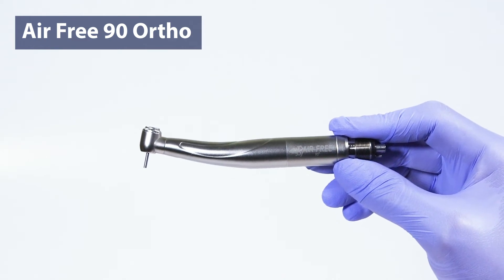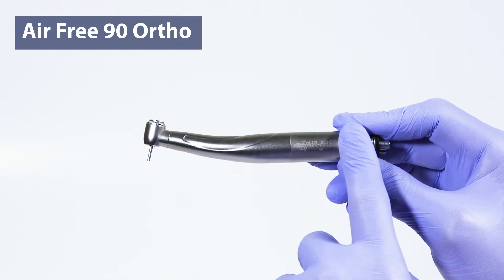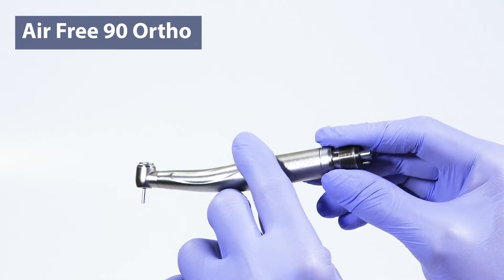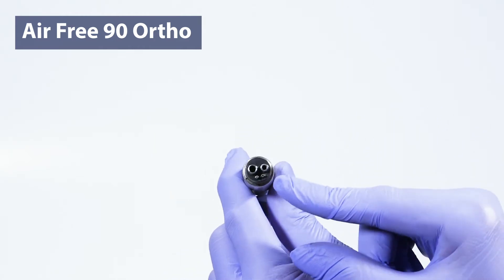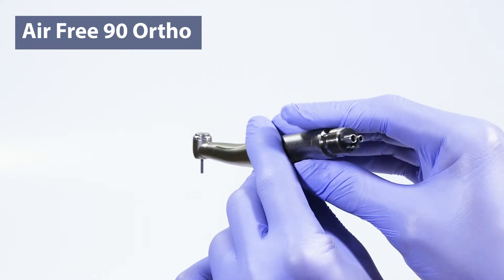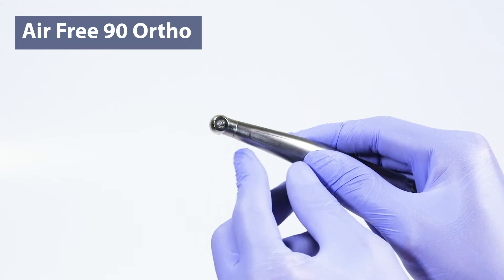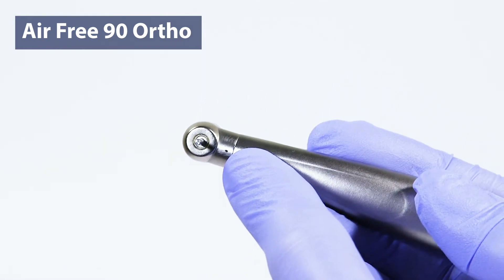MediDenta's AirFree90 is the first 90-degree high-speed designed specifically for orthodontists. It features a stainless steel titanium-coated shell and is fixed with an industry-standard four-hole configuration. The compact head features a pure water jet stream cooling system for proper irrigation.